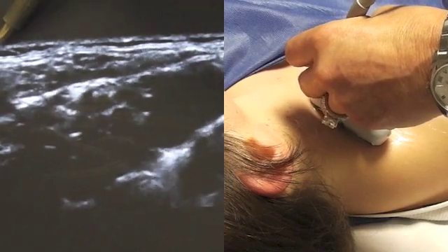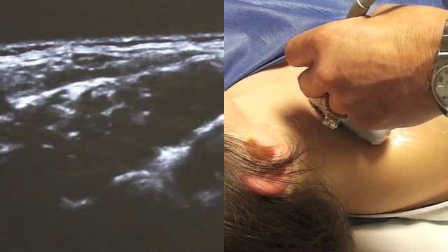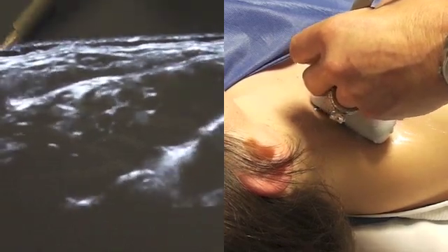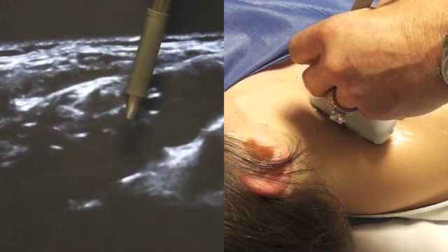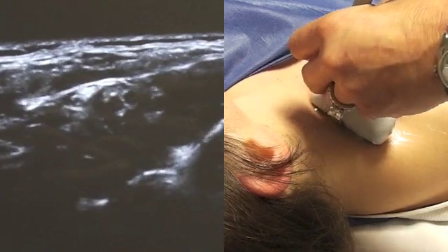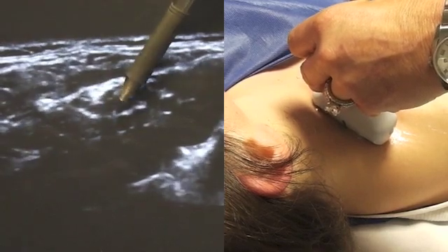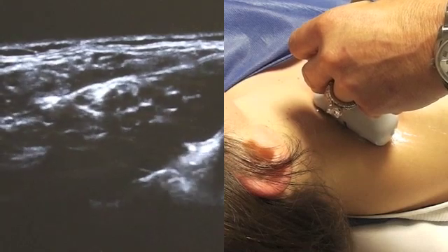We're going to insert the needle here. She's very superficial — about a centimeter below the skin surface — so the insertion will be a very shallow approach, immediately hugging the ultrasound probe. As the needle is inserted, it will come in here, and our first injection will be deep in the corner pocket, as they say, to make sure we anesthetize the ulnar nerve. We'll inject 15 ml of local anesthetic in the corner pocket. Once we confirm spread of local anesthetic, we will remove the needle about half a centimeter and inject more superiorly to get the upper levels of the brachial plexus.